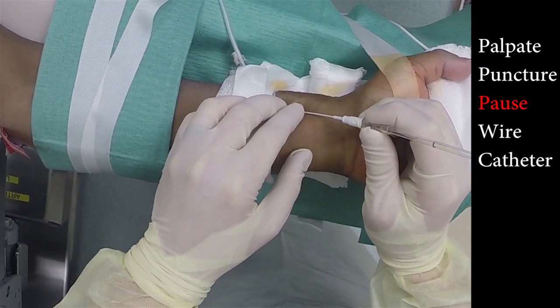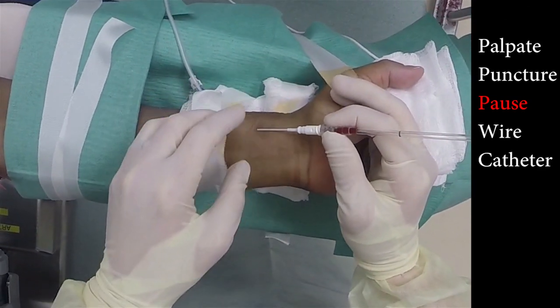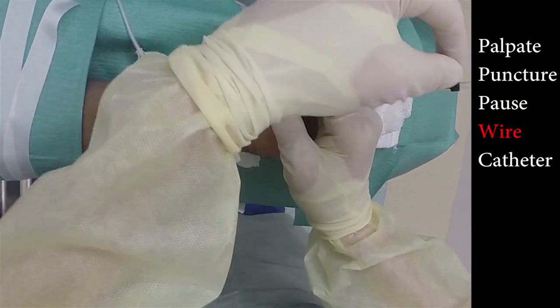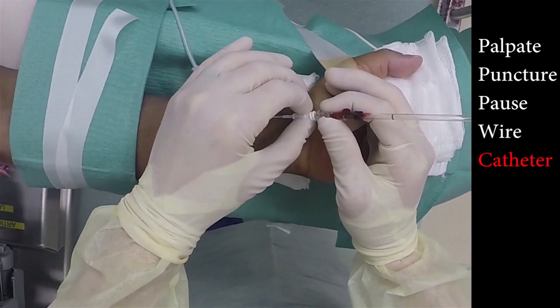Five points are located on the right side of the screen: palpation of the artery, puncture of the skin, pausing which we will discuss later, threading the wire, and last, threading the catheter.